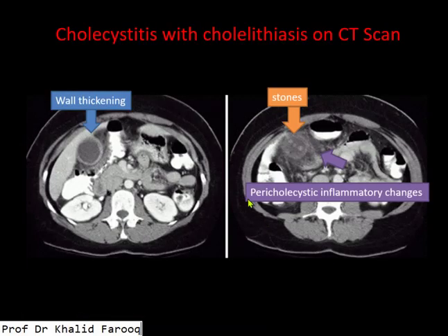Another example here: we see diffuse wall thickening of the gallbladder while inflammatory changes are noted in the pericholecystic space. Here we have multiple calculi in the fundal region of the gallbladder, so we will say that this is an example of cholelithiasis with cholecystitis.